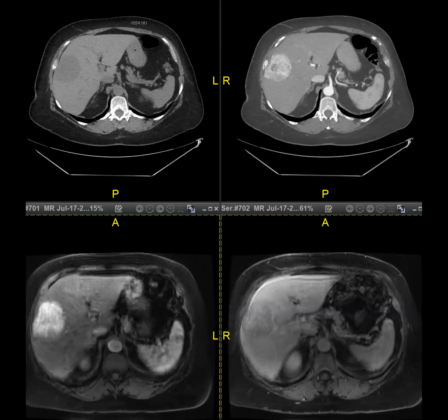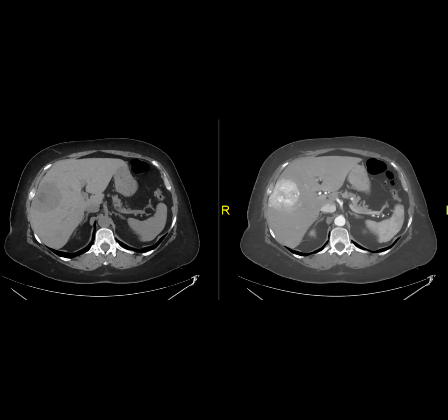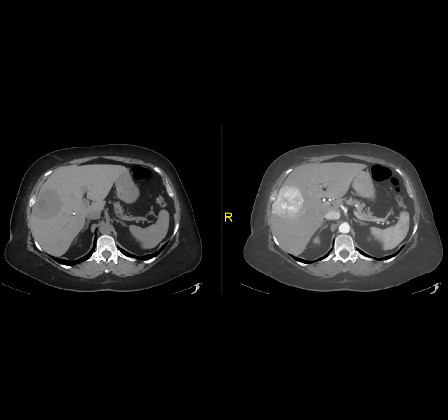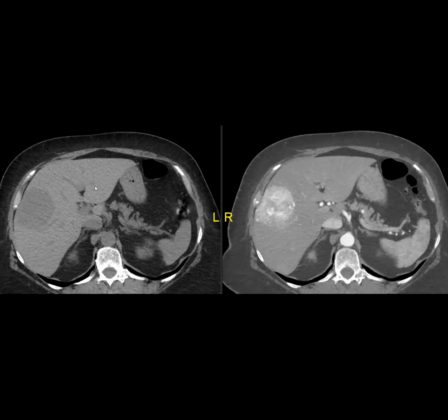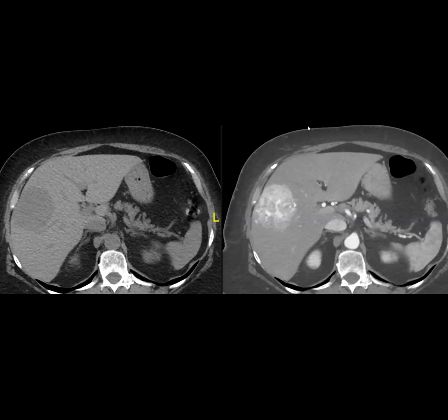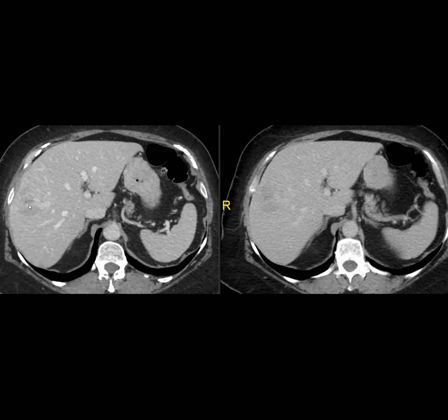All right, this is another one, and this one actually has an MR. Same history. The patient has no history of parenchymal liver disease. Now, if I do this, do you see 4 images or 2 images? 2. Okay, so you can see a very similar appearance: kind of lowish on pre, very avidly enhancing in the arterial phase, and then heterogeneous with some areas that wash out.